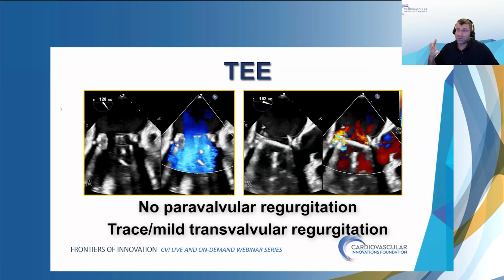Now, some people argue this is a prosthetic device, and yes, it's a little bit of a gray zone on what to do chronically with those. But I would still, at least for diagnostic purposes, to see what this material is, and to disrupt these ongoing recurrent CVAs. So.